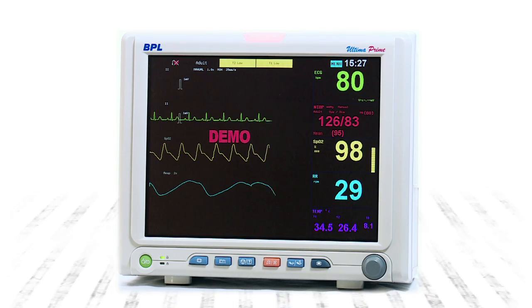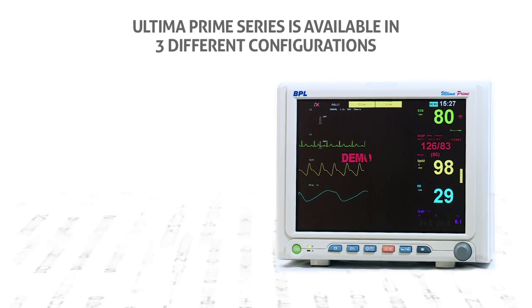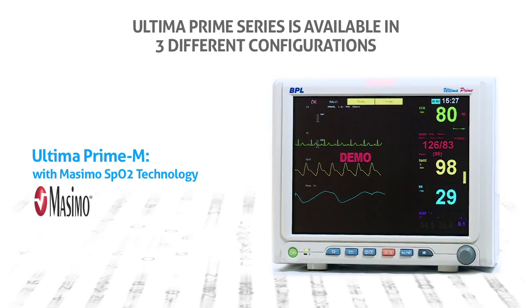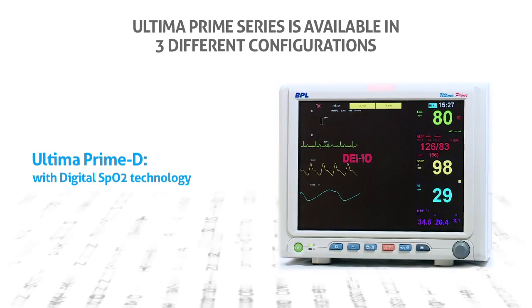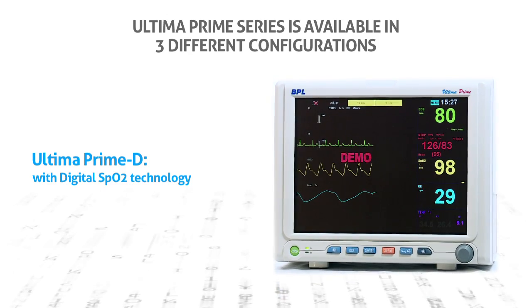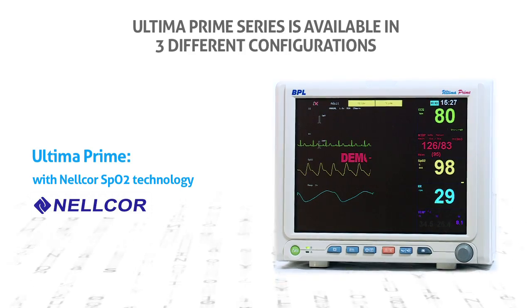Ultima Prime series are available with three variants for all your critical care needs: Ultima Prime M with Masimo SPO2 technology, Ultima Prime D with digital SPO2 technology, and Ultima Prime with Nellcor SPO2 technology.